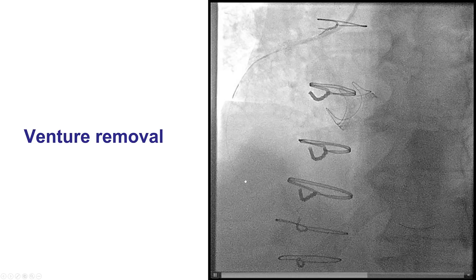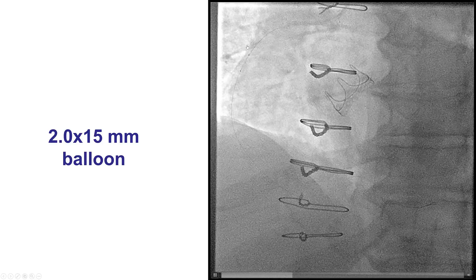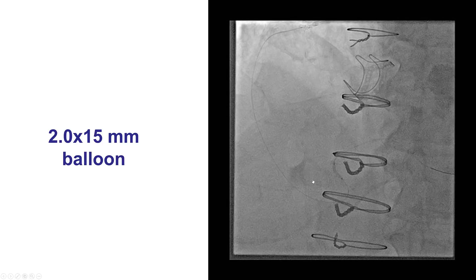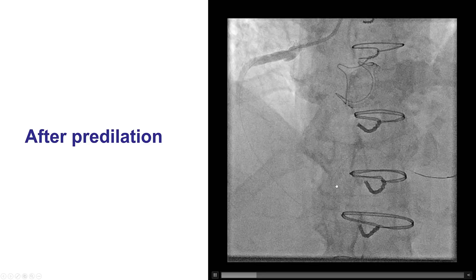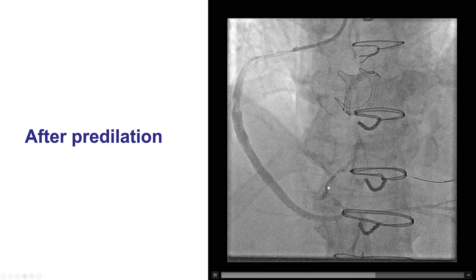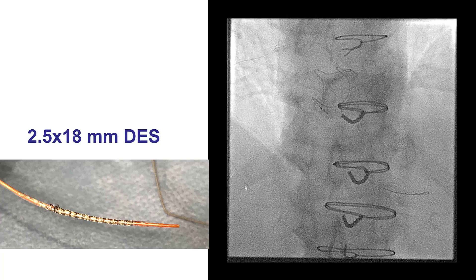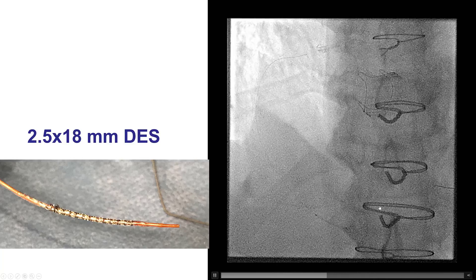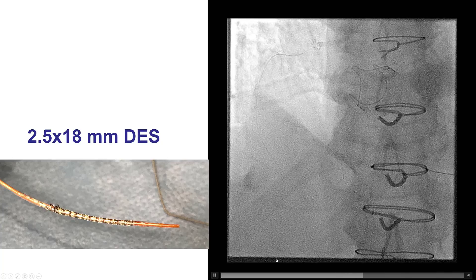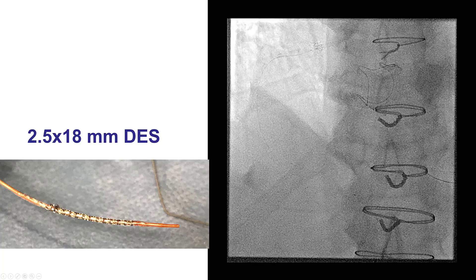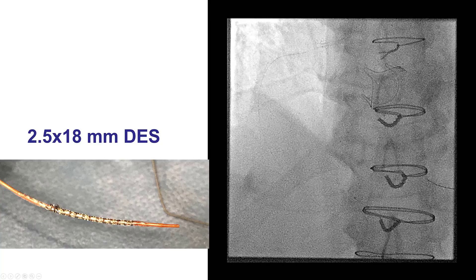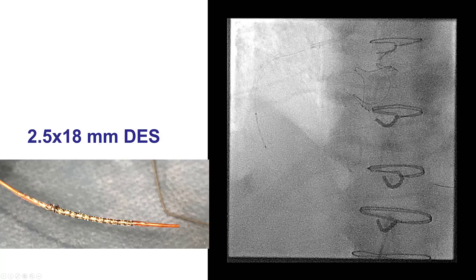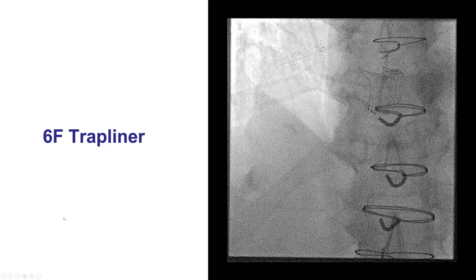The Venture catheter was removed and we pre-dilated with a small 2.0 by 15 mm balloon. There was some significant calcification at the target lesion, but the balloon seemed to expand okay. We then decided to advance a stent. However, we had significant difficulty delivering a 2.5 by 18 mm stent, and on the way back there was a lot of resistance. When the stent came back, there was deformation of the proximal edge — a common mechanism for losing stents. If one pulls hard and the proximal edge catches on the guide catheter or guide extension, the whole stent can be stripped off. Fortunately, that was not the case here.